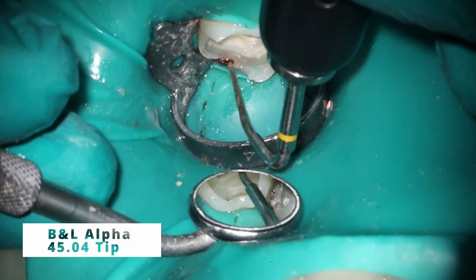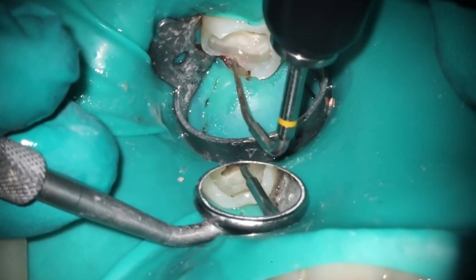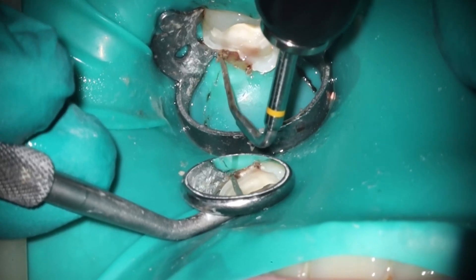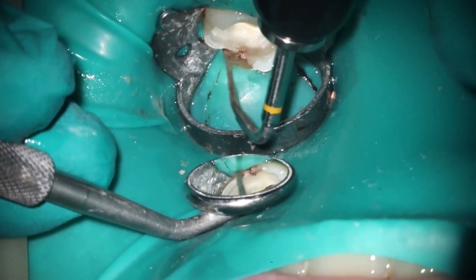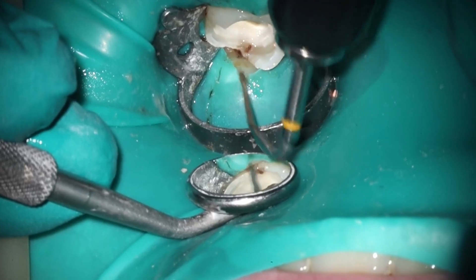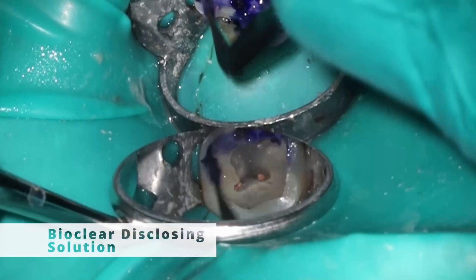Everything looks good as far as the check film. So I'm going to do just a little bit of cauterization with a BNL Alpha One. One cool trick: with a heated tip, most of the time if you hit the rubber dam, it will actually kind of melt away really nicely, exposing that area. I want to make sure we have clear access and no bleeding points in this area.